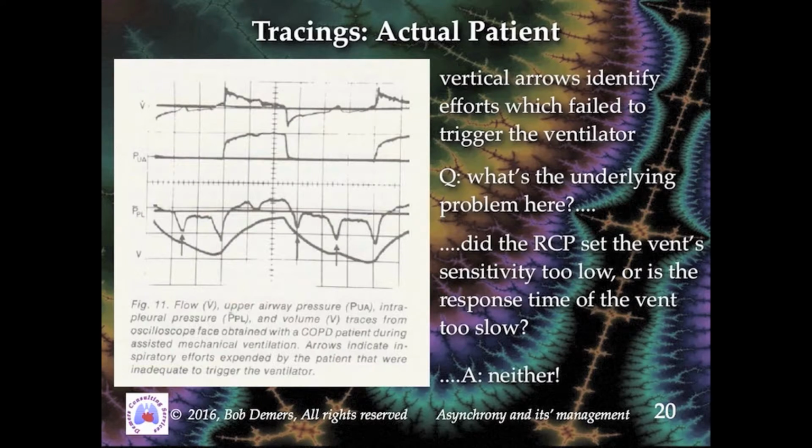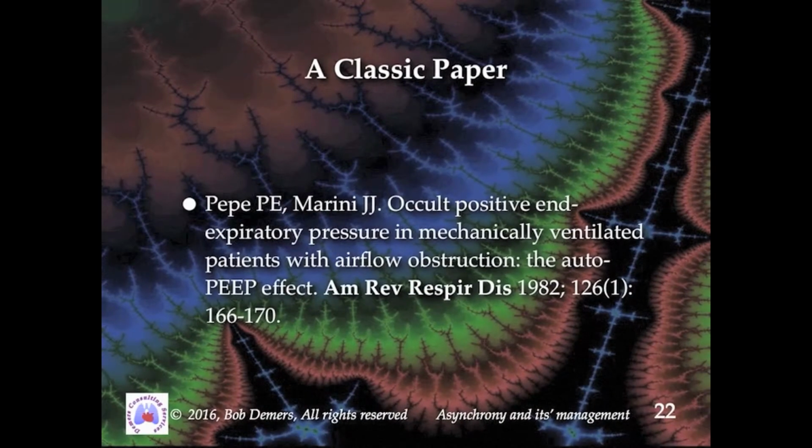Certain populations of patients are vulnerable to asynchrony, and the module describes in detail why the presence of an elevated level of expiratory flow resistance is likely to result in asynchrony. Because so-called auto-PEEP is commonly associated with asynchrony, that disorder is examined closely, and the mechanism of interaction between auto-PEEP and asynchrony is clarified in order to enhance caregivers' understanding of the respiratory mechanical basis of the two conditions.